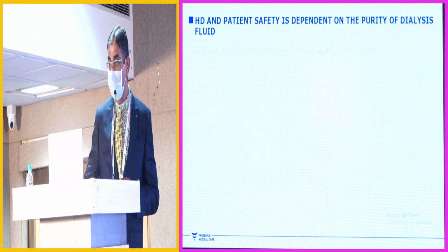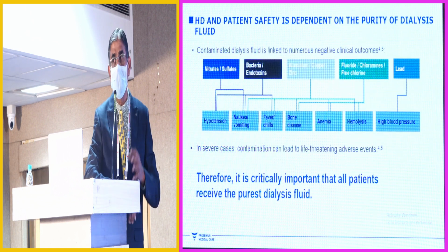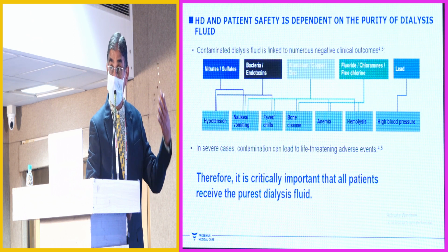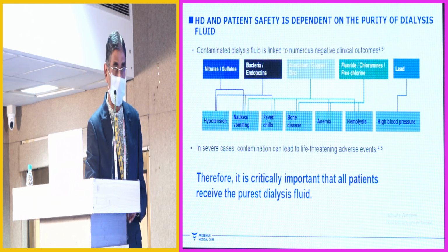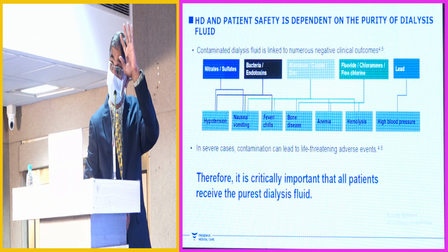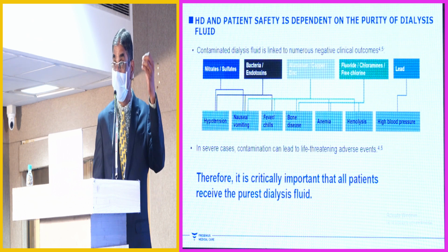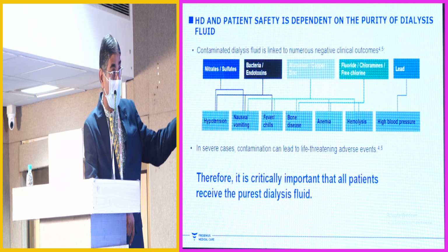So how to achieve this purity of the dialysis fluid? I, as a therapist, have been working since 1987. We were using the DM plants, which we found very difficult, and I'm really thankful to Professor Mani, who is Padma Bhushan. I am the first student of his who went abroad, for more than 20 years. In those days it was a very, very cumbersome process. But now, with the latest pore size of 0.0001 micrometer of the RO membranes, which are also polysulfone polyamide, we are able to achieve these standards.